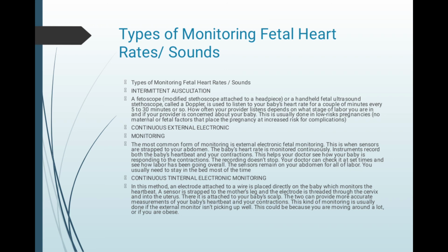This kind of monitoring is usually done if the external monitor isn't picking up well. This could be because you are moving around a lot or if you are obese.